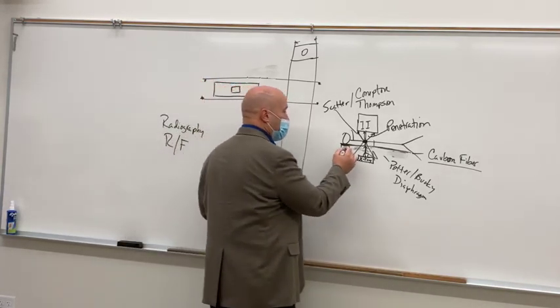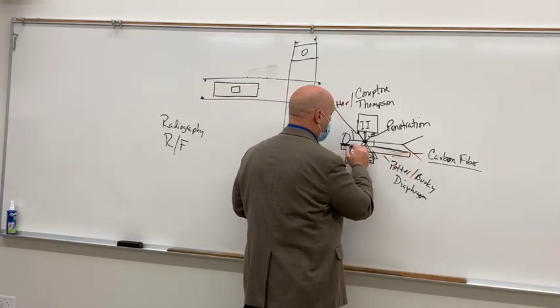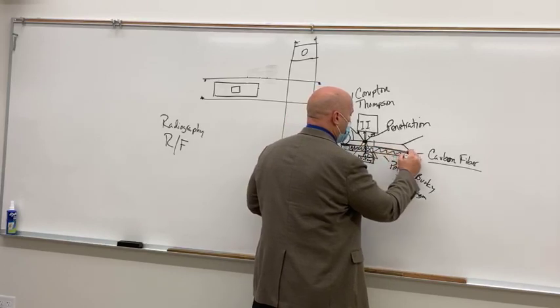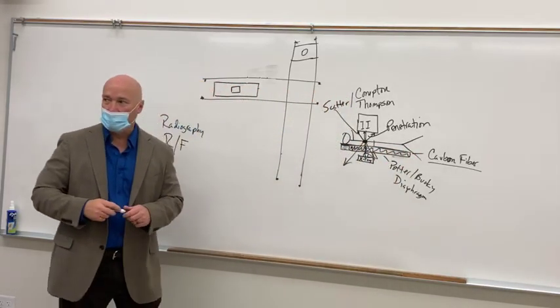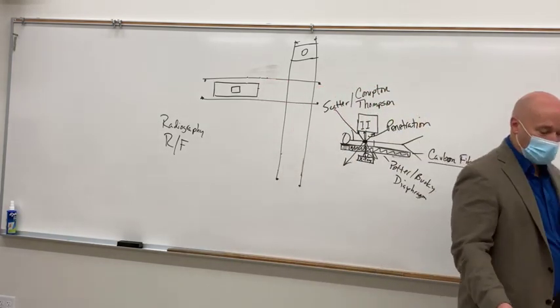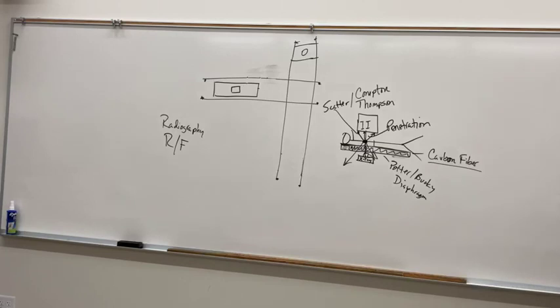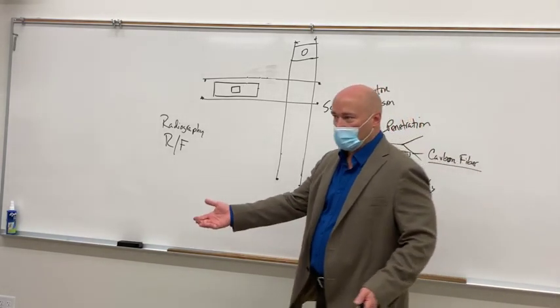What you've got in the bucky, or attached to the bucky, is a solid plate that travels with the bucky. You grab that bucky and drag it down to the foot of the table, and you're going to see you've got a plate on both sides of it that moves with it, right? You drag it up towards the head of the table and it moves with you that way as well.